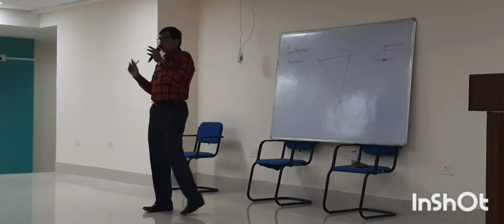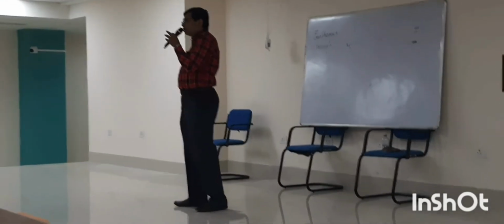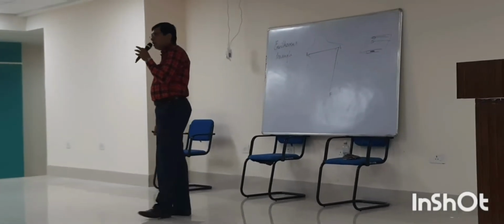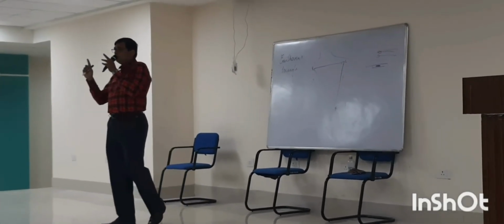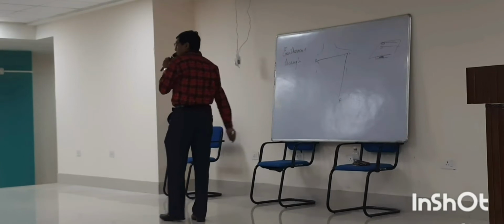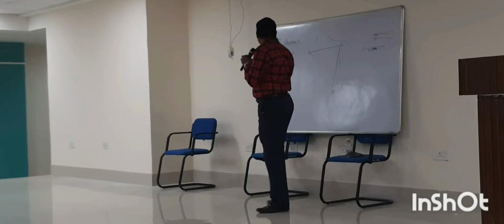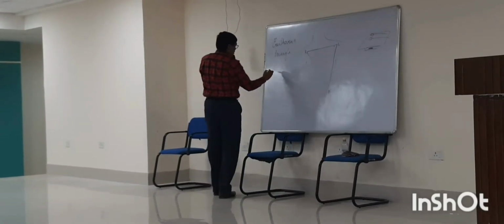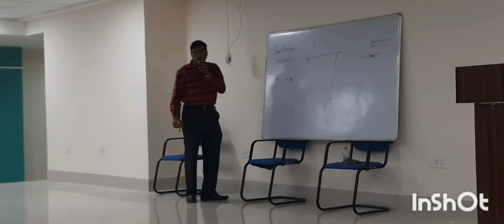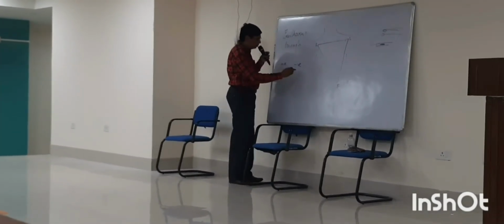The specific positions of the body, on the basis of the position of the leads, can be called bipolar leads and unipolar leads. Bipolar leads means there are two poles, and two poles have potential differences. So according to Einthoven's law, bipolar lead 1: positive pole is the left arm, negative pole is the right arm.